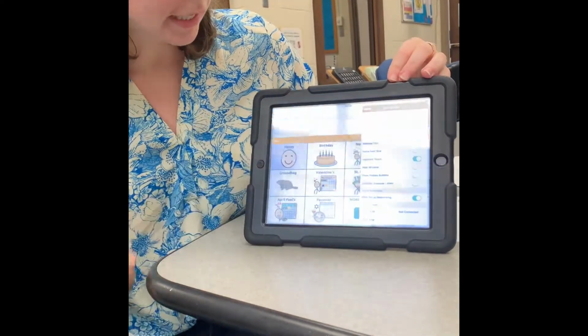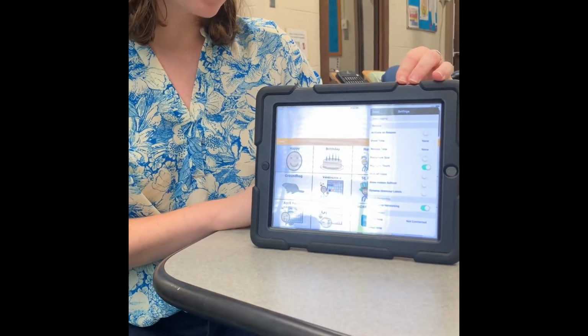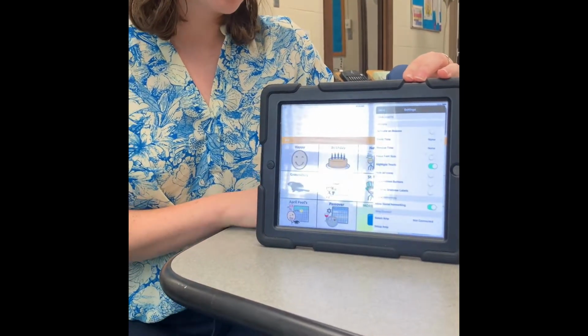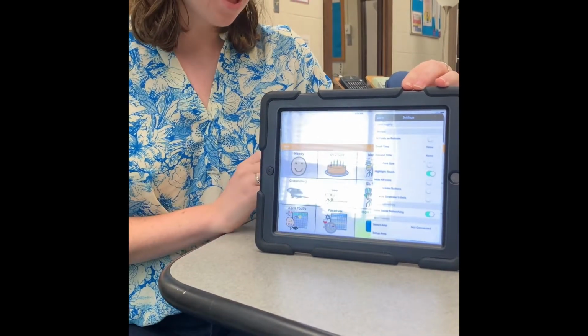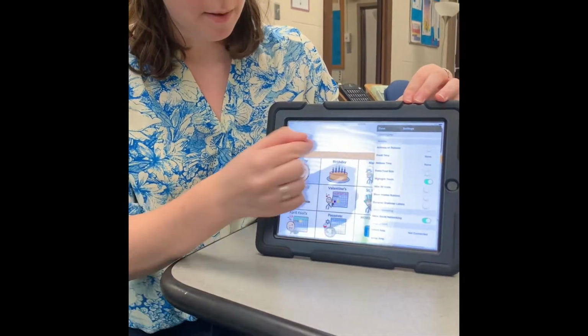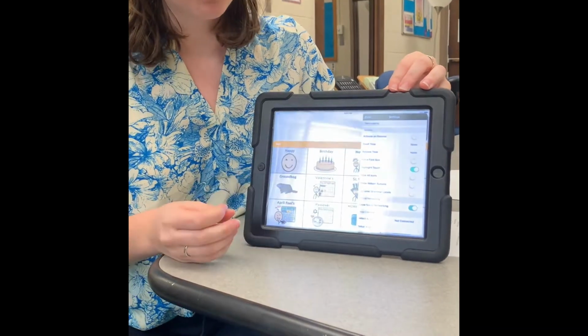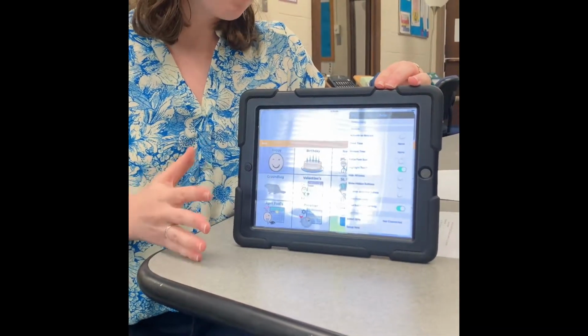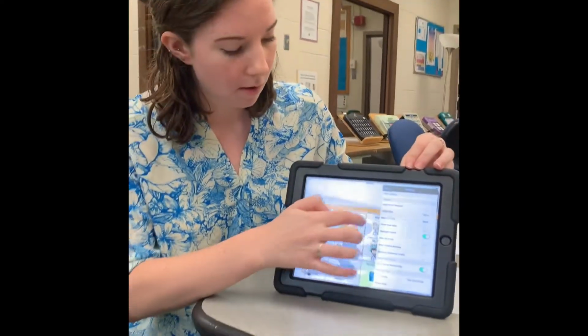And there's also a release time option. This is intended to help prevent accidental double button activations. When the time is set, all buttons are disabled for the specified period of time after each button press event. So if I press a button and I accidentally press another button real quick, it will only register the first button I pressed. A value from 0.1 to 5 seconds can also be chosen for this button option.